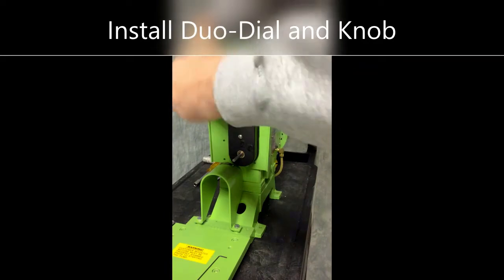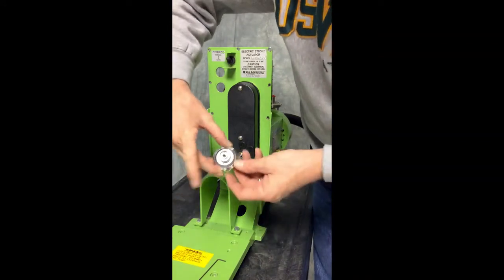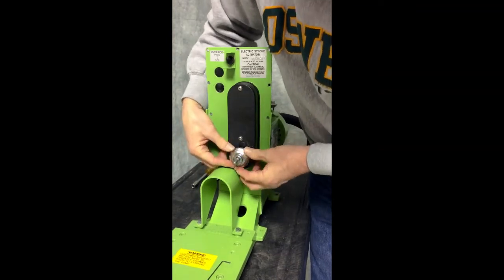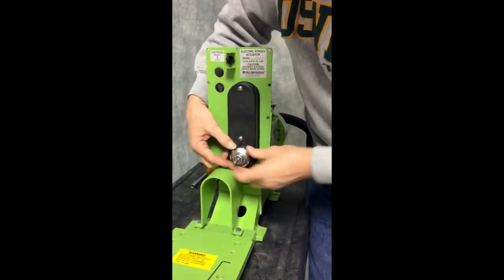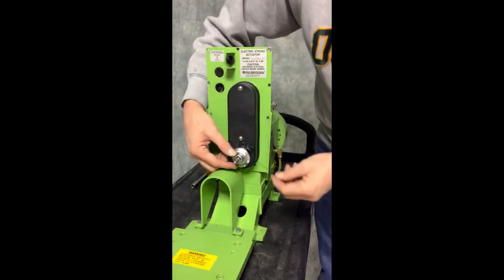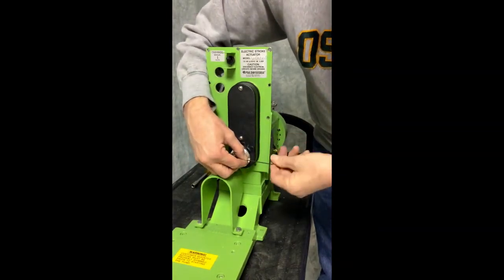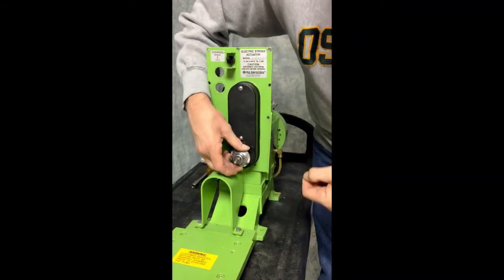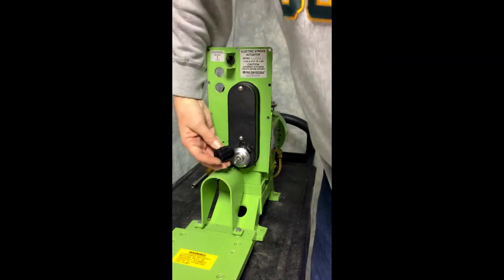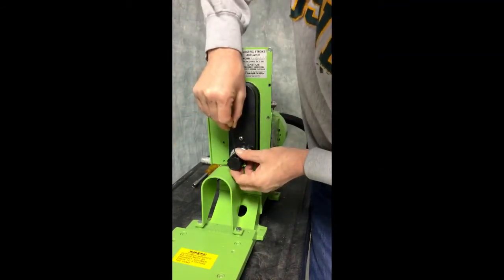Once the cover is on, tighten down the two screws so that it is firmly in place. Take your dual dial and re-install it, making sure that the key fits into the hole in the back as noted earlier and that the dial is at zero. Tighten that down. Then tighten down the two Allen head screws for the handle. With those screws finally tightened up, you should be all back together.